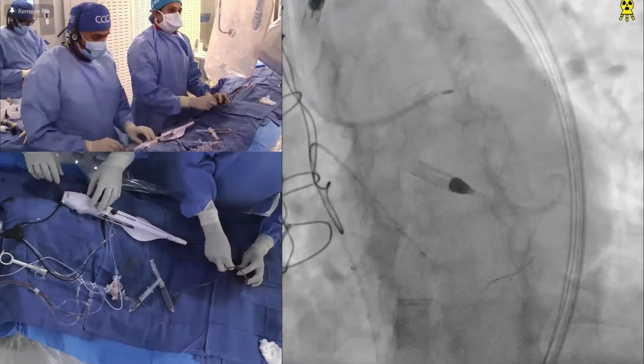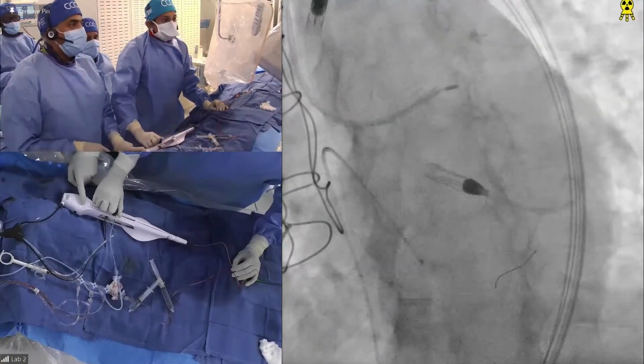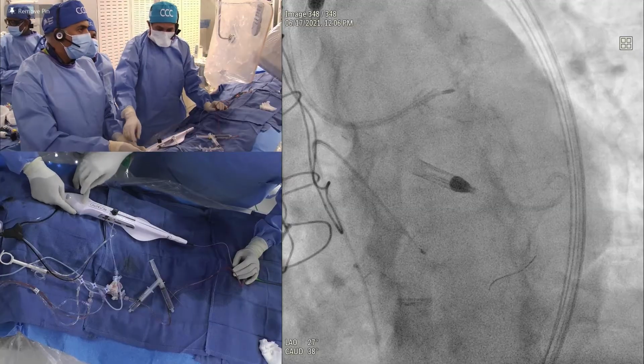So Dr. O'Neill, one second. Dr. O'Neill? I found the Turnpike LP probably the most crossable of the microcatheters.